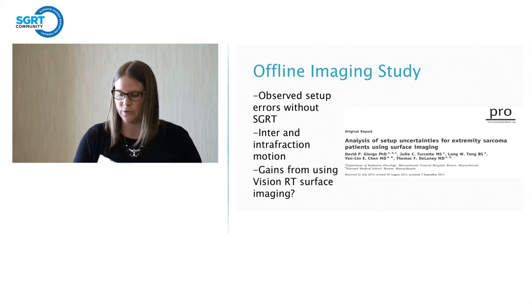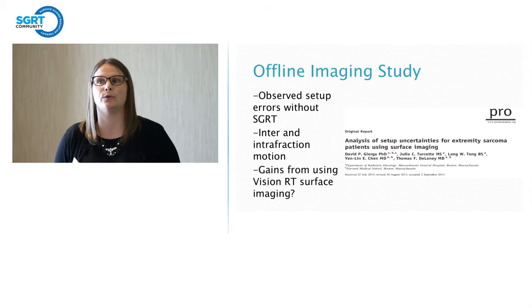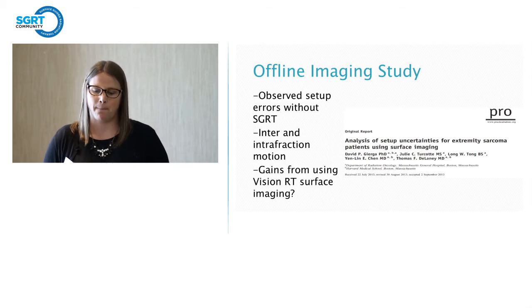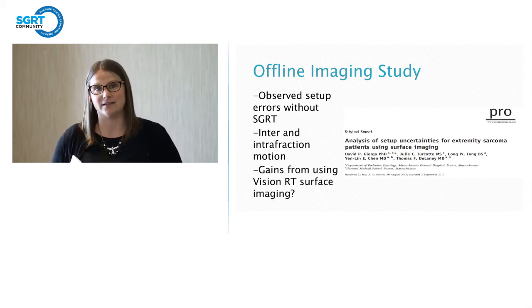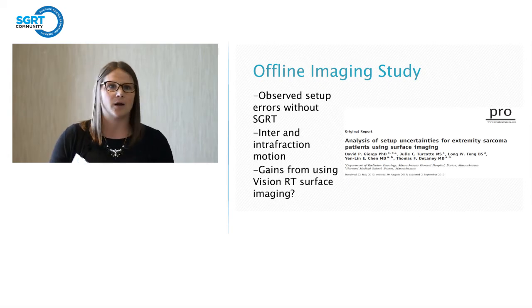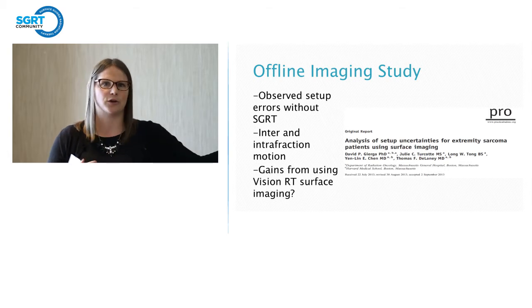So we've been doing deep inspiration breath hold for a long time, and we were using Vision RT. We were able to decrease our treatment times on the breast machine from 15 minutes to 12 minutes after implementing SGRT. We were noticing that our sarcoma machine was running behind schedule on average an hour every single day in 20-minute time slots. So each of these sarcoma patients have these custom boards. They're big, they're awkward, they're heavy. It's also the thoracic machine, so you've got vac lock bags with these boards. You need 2 therapists to go in to change the room over by the time you get your patient in. It's just kind of a lot of lost time.